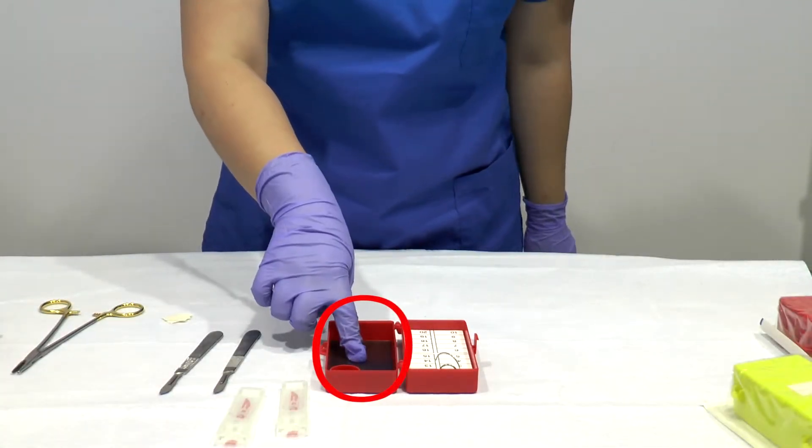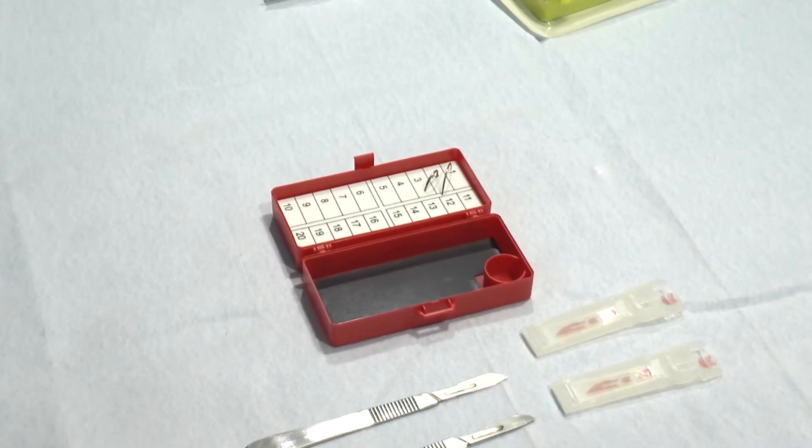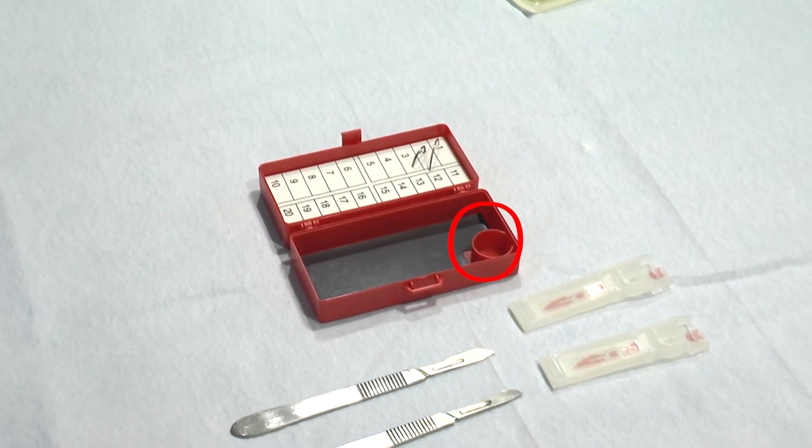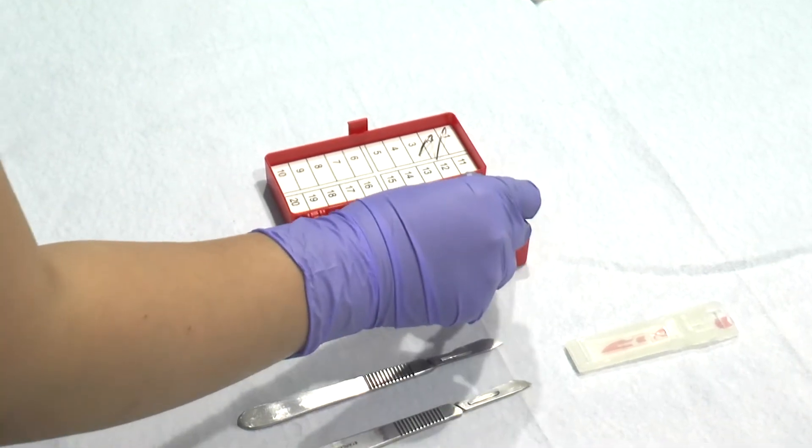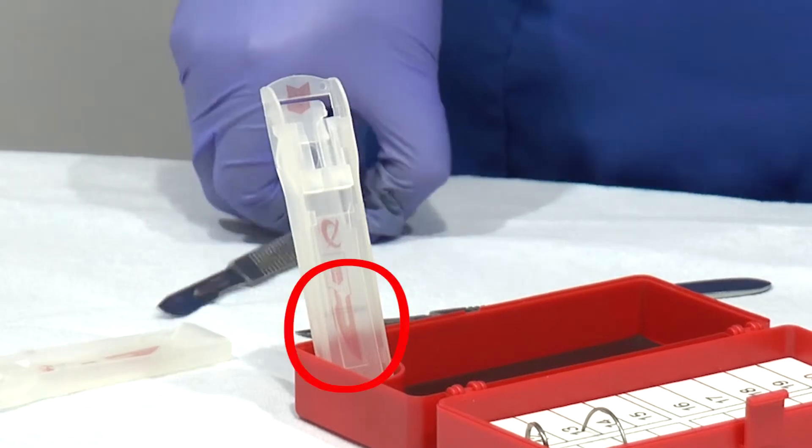To remove used scalpel blades, place the blade remover cartridge onto the round holder. It is round to enable you to face the cartridge in any direction that's comfortable for you. Make sure that the scalpel is facing the same direction as the red guide on the cartridge.